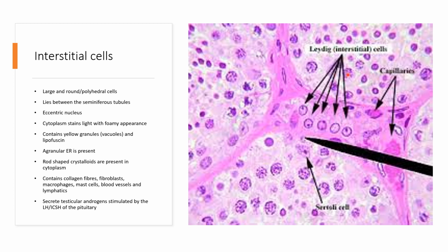So you can see this tubule right here, this one right here, and this one right here, and within that communication you are going to see the interstitial cells, or what we call the interstitial cells of Leydig. Some people say Leydig cell, but the English name is interstitial cells. Leydig is just the name of the person that discovered it. So we normally say interstitial cells of Leydig or interstitial cells.